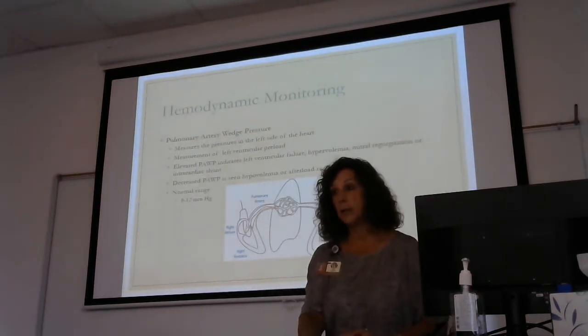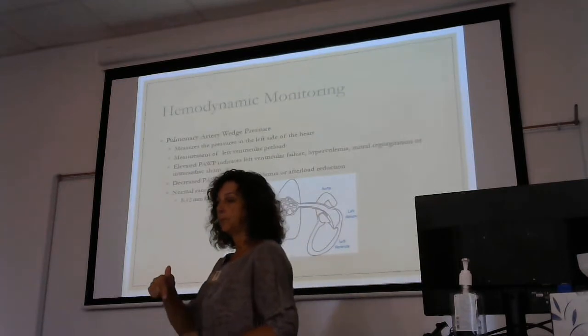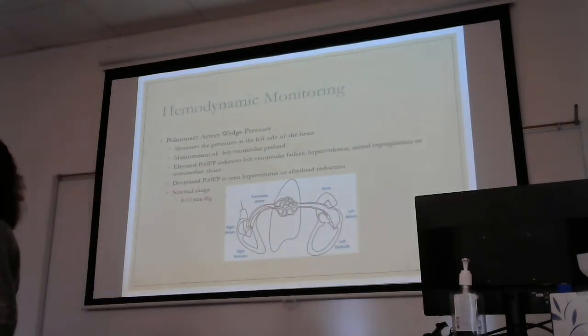Now, again, even though we don't do these today, you have to understand what they measure because your physicians might do them, okay? And we had one not too long ago where the nurse asked me, can we wedge balloons? I said, not anymore, you can't. Your provider's going to have to do that. But looking at your monitor, you'll understand. I'll show you the waveforms, how they change. But you have to know what a wedge pressure is going to tell you.